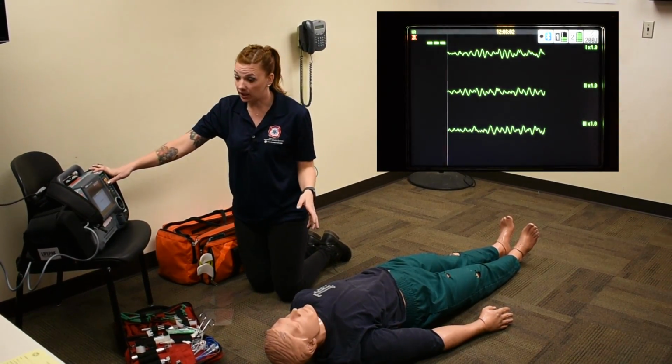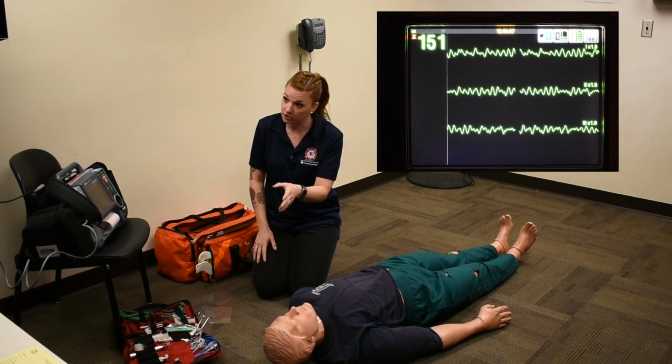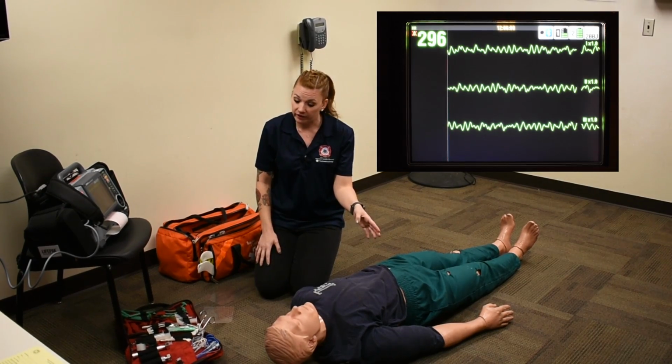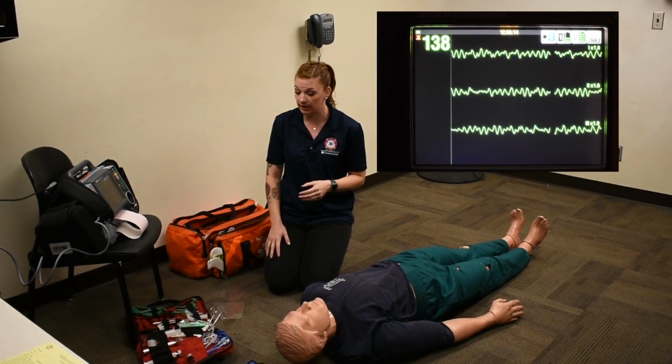Continuing again, CPR. I want to drop an OPA and start bagging my patient with a BVM at 15 liters high flow O2. I already have an IV in place, so on my next round of CPR, I'm ready to give my epinephrine, 1 to 10,000.